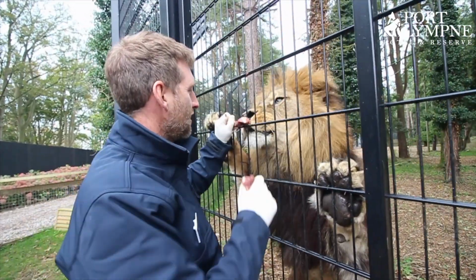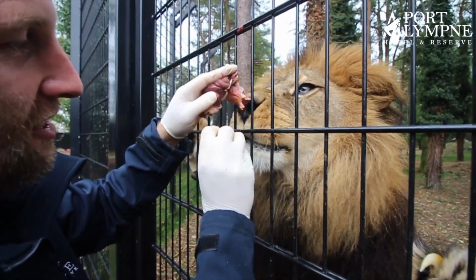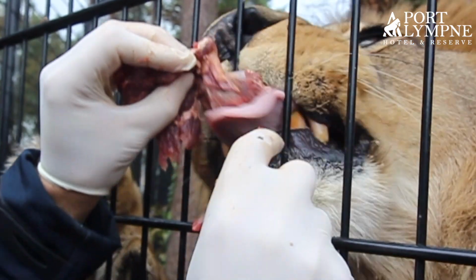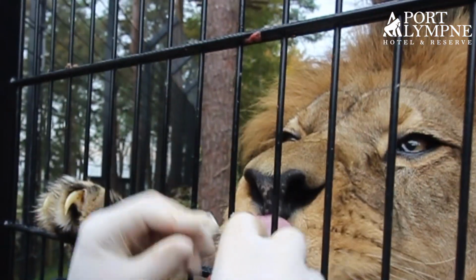If you look really closely, I don't know if you can see that on him, you can see on his canines, if he leaves it out long enough, there's the little hole at the front where he drilled through to be able to get down and clean all the pulp out.